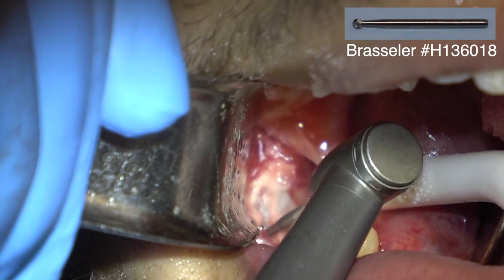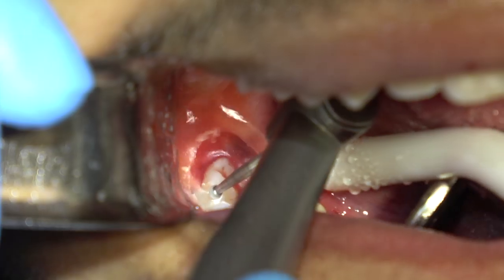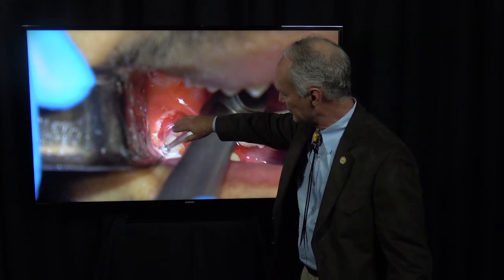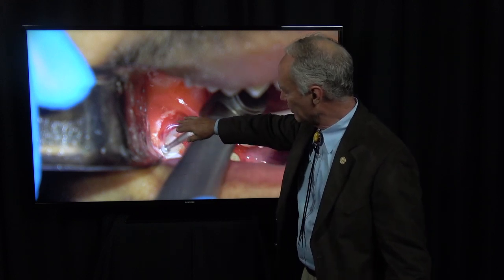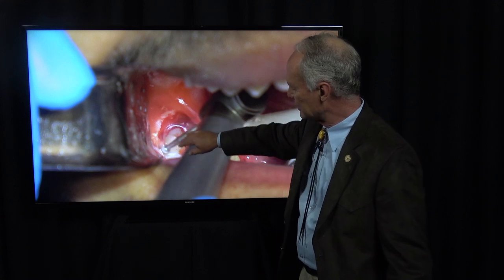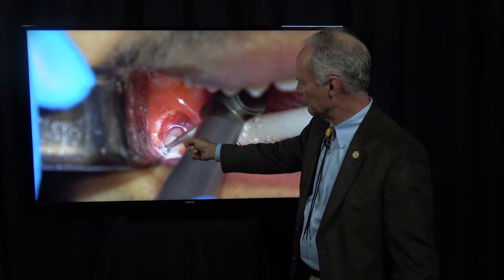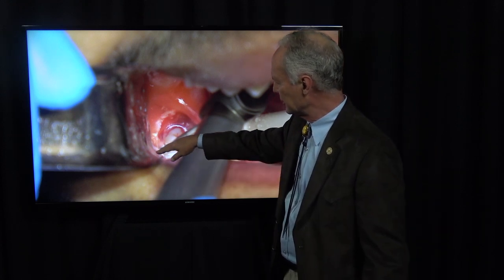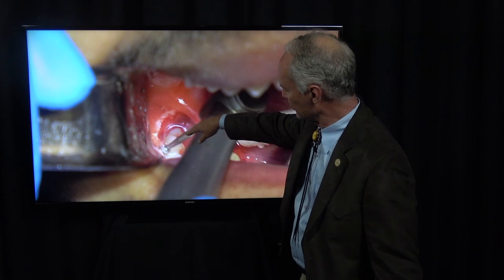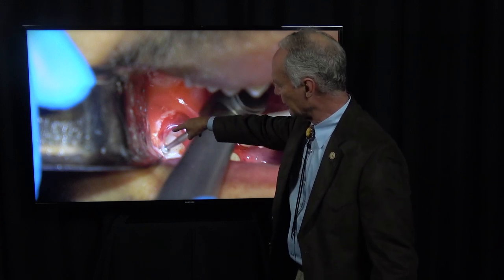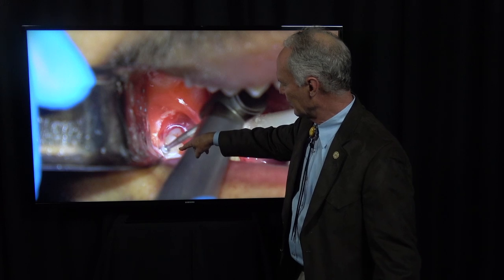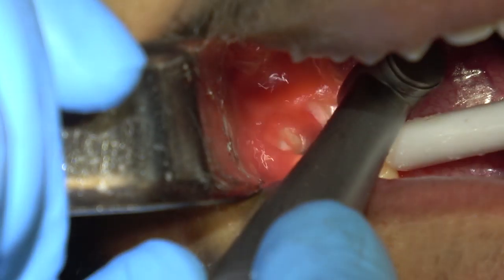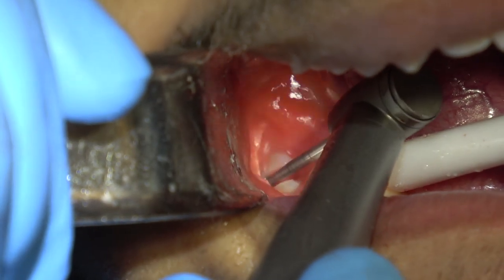You can see the impacted wisdom tooth. This is a long shank number six or number four round burr. I'm cutting primarily into the tooth more than the bone, just to create some space into which to move the wisdom tooth when I section it. I'm going to section the tooth through the occlusal to the furcation and separate the distal part of the tooth from the mesial part with this long shank number four or number six round burr.